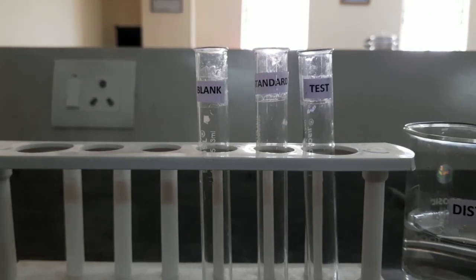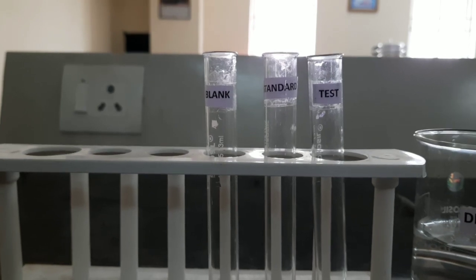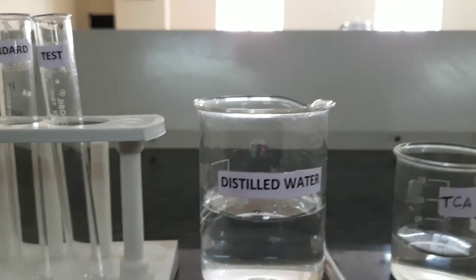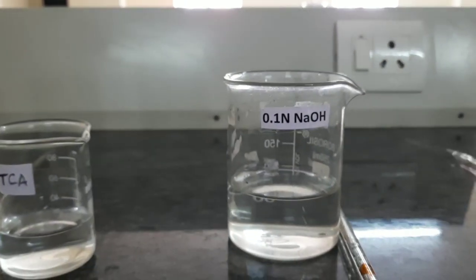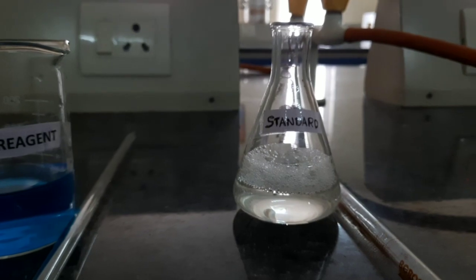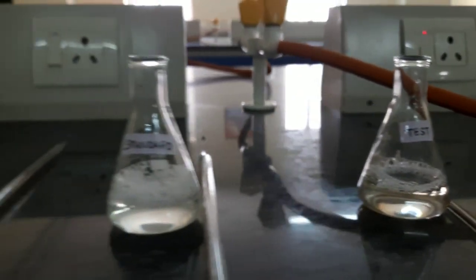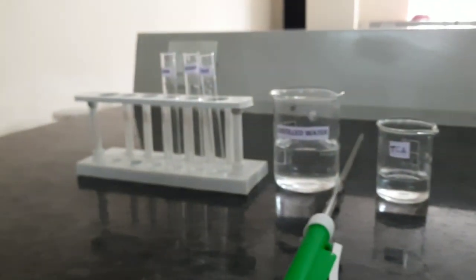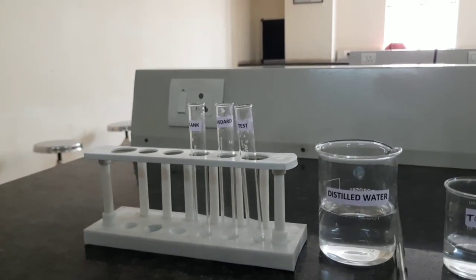So let us see the requirements for protein estimation. We need a set of 3 test tubes, distilled water, TCA which is 20%, 0.1 normal NaOH, biuret reagent, standard protein sample which is 1% and urine sample. So these are the requirements for protein estimation in urine sample by biuret method. So let us begin with the performance.